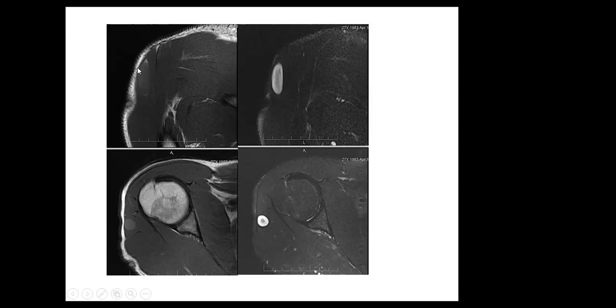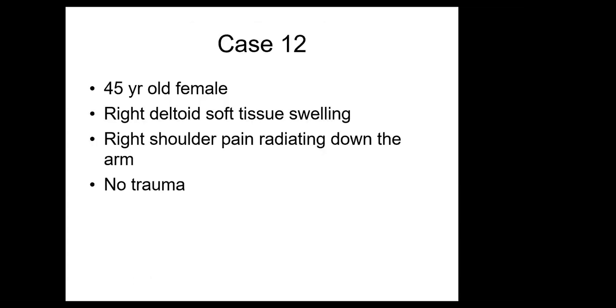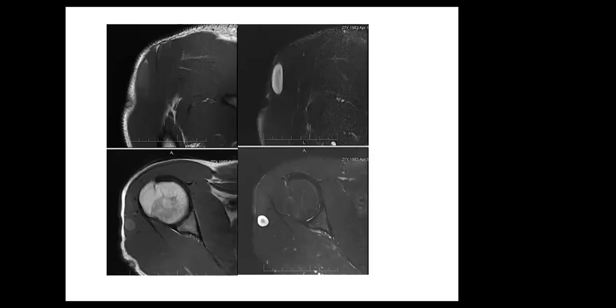Yes. Okay. So you need to make observation of all the findings. When you call it nerve sheath tumor, you have to convince me that it is nerve sheath tumor and provide me with all the radiologic features of soft tissue tumor. So split fat sign, the target sign, and also going back to the history of this patient, pain shooting down the arm. It's more a neurogenic pain. Okay. Yes. And then the other thing, remember our system: describe the findings, interpret the findings, differential diagnosis, and further management. So what is the further management for this patient?